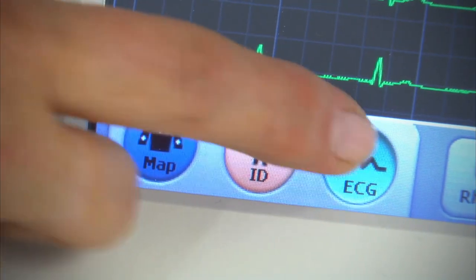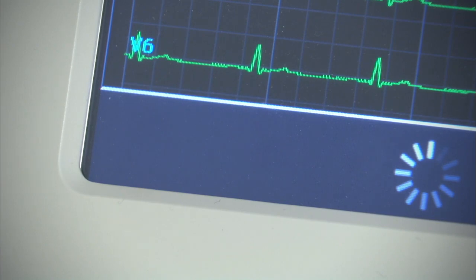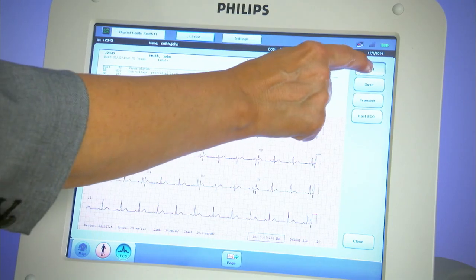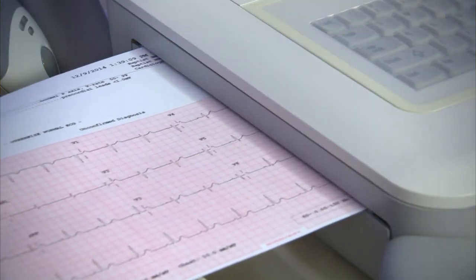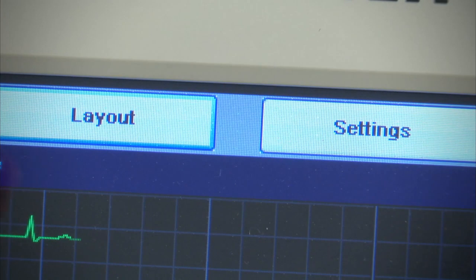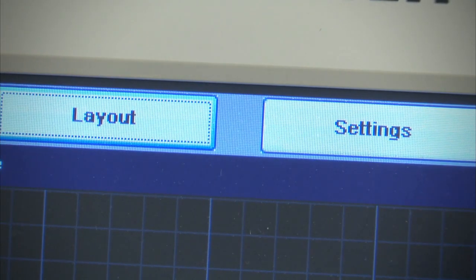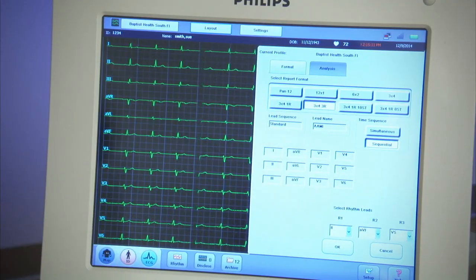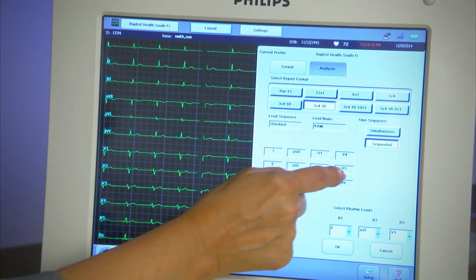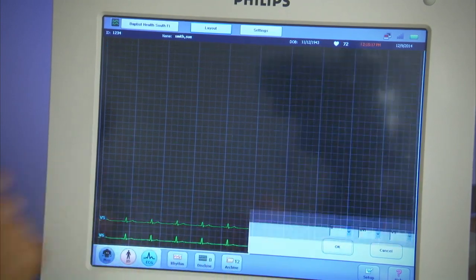The default layout of the 12-lead ECG when it is printed is configured in the cardiograph. For example, the configuration may default to a standard 3x4 with a single rhythm lead 2. However, that can be changed on the fly with the current ECG being taken if desired without changing the default settings in the cardiograph. For example, to change the print layout to 3x4 with three rhythm leads 2, AVF, and V5, touch Layout and select Report Format.